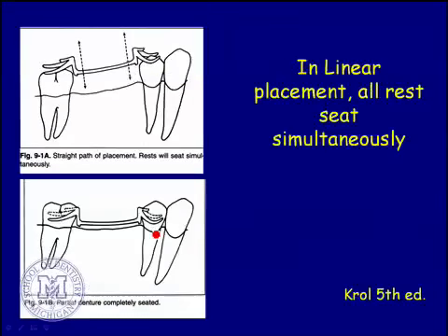Okay, in the linear placement, again, all rests seat simultaneously. So if it's not a curvilinear, if it's not a rotational path, it's just a straight up and down path of insertion, for the most part, all the occlusal rests seat pretty nearly simultaneously.